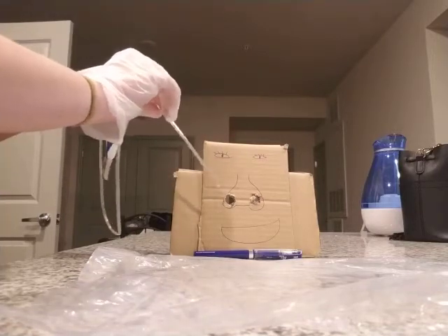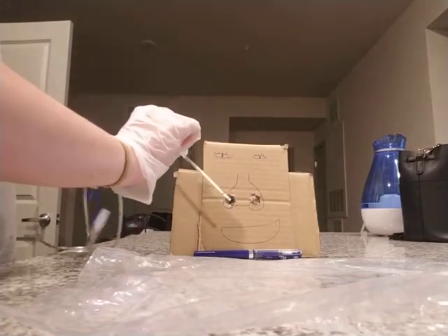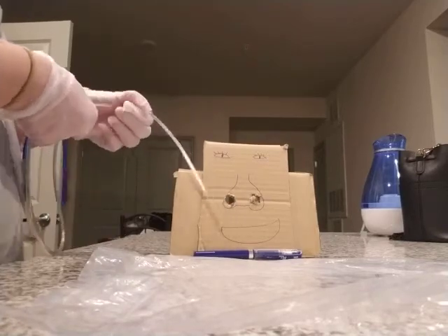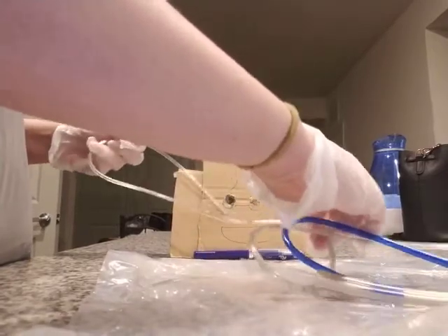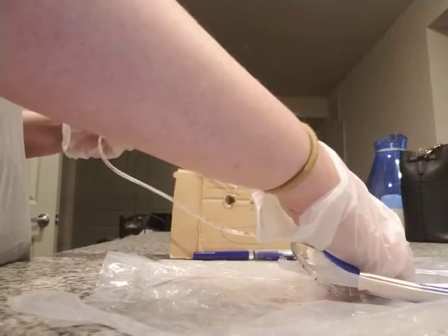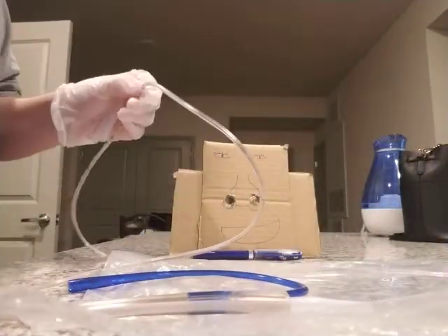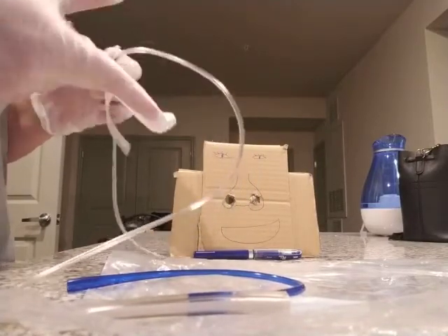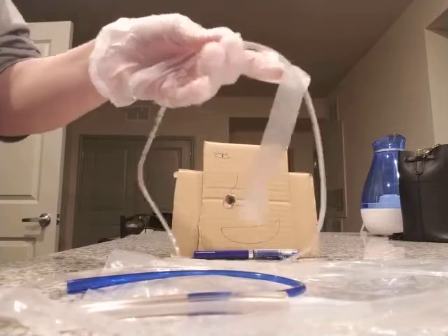I'm going to measure from the tip of the nose to the ear, which I'm going to imagine is like over here, and then to the xiphoid process, which would be for Gladys like right here. And then I'm going to mark that place with a piece of tape. And now I'm going to put that down for a second.